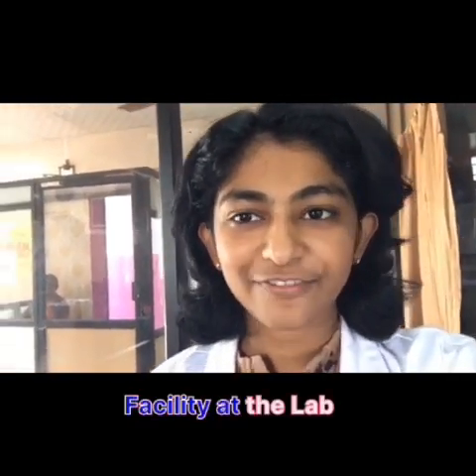And then based on the lab results, the physician will diagnose and treat the patient accordingly. Another specialty about this laboratory is that they also undertake research projects related to life sciences and focus mainly on zoology. So coming to the facility that we have here, we have several equipments for clinical processing, and the most important one is the biochemistry analyzer.